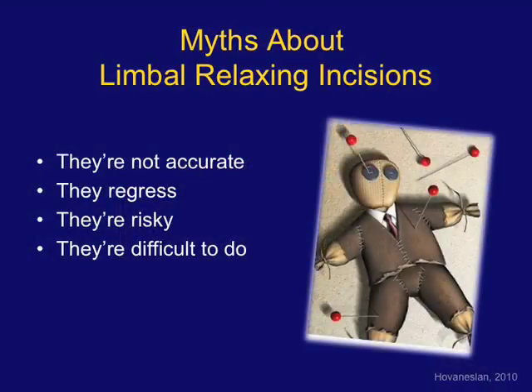Many surgeons are reluctant to begin using LRIs in their practice because of a number of perceptions that the LRIs are not accurate, that they have a risk of perforation, that they are technically difficult to do, and that they may regress. And as we're going to show in this video, with the right approach, LRIs involve very simple calculations and a lasting refractive effect that doesn't wear off.